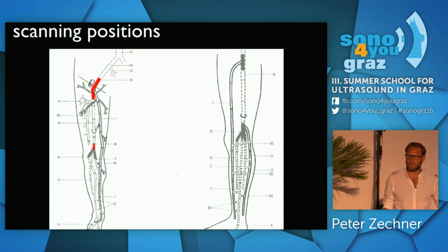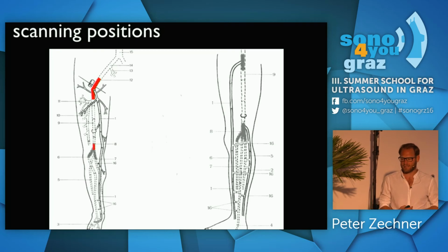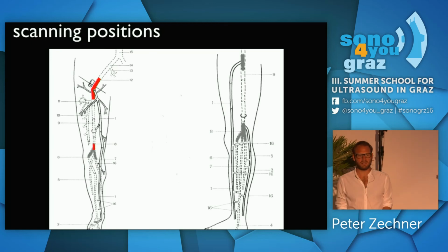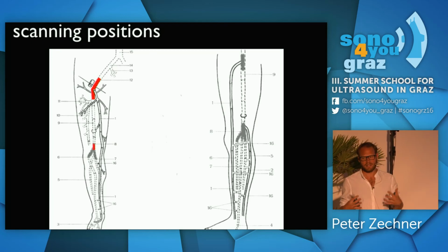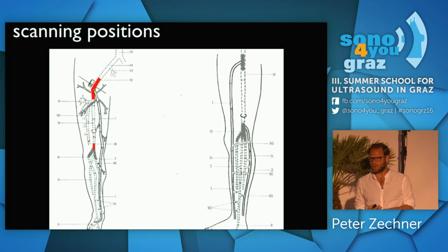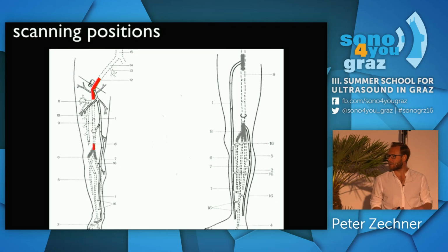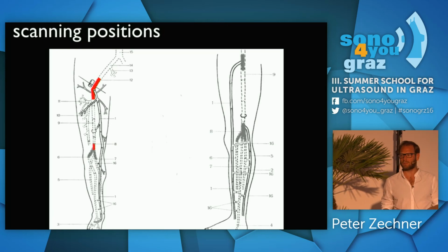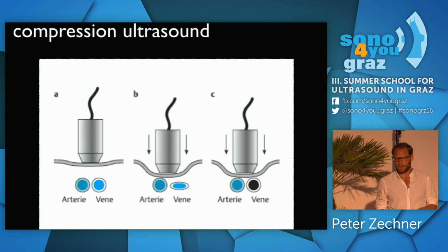We won't be able to find or exclude this thrombosis, but if our exam is positive, we know that this patient has thrombosis, and at least this exam is easy and quick to do, so it's always good to have a look at it, but we cannot be sure that we do not miss smaller thrombosis on the lower leg. That's important that you know before.